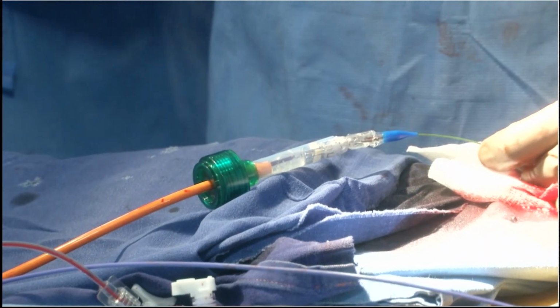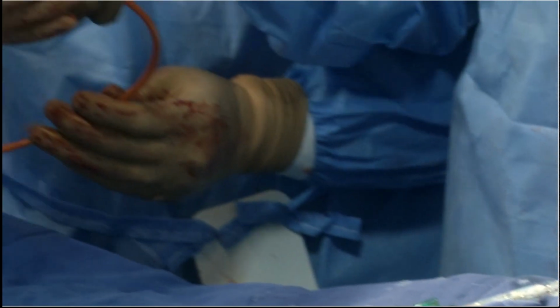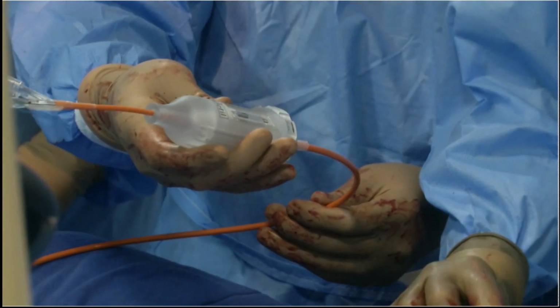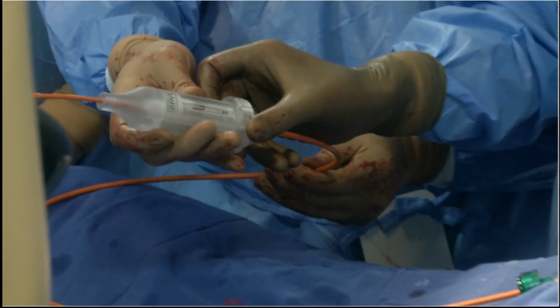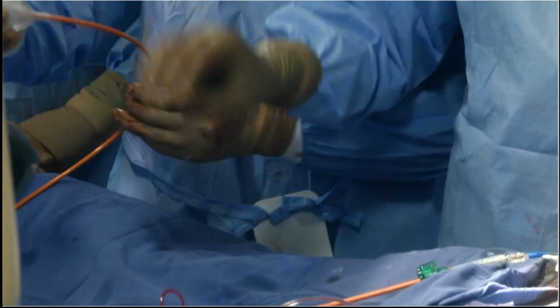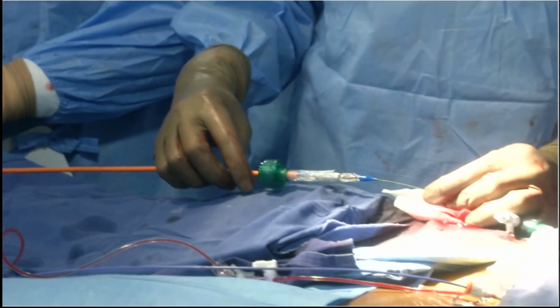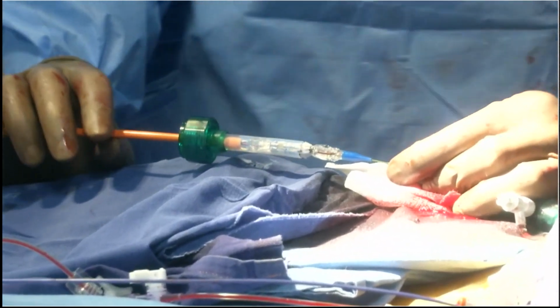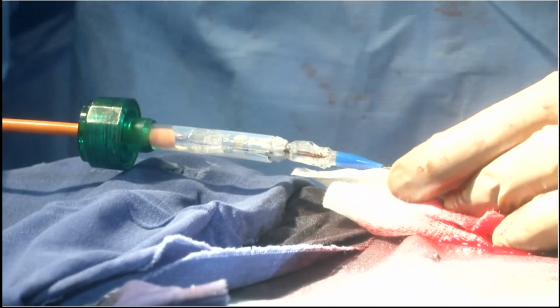The handle has a wheel, which can be rotated to flex the tip of the catheter. So this delivery system, we can flex it. You can see the arrow marks. It's already crimped on the balloon, so we don't have to position it inside. We could go directly inside, just like a stent, and deploy.